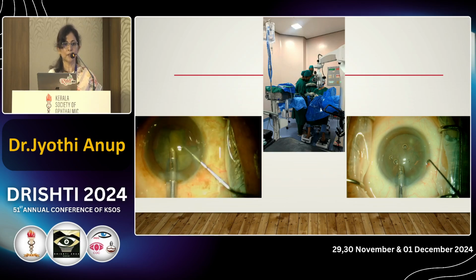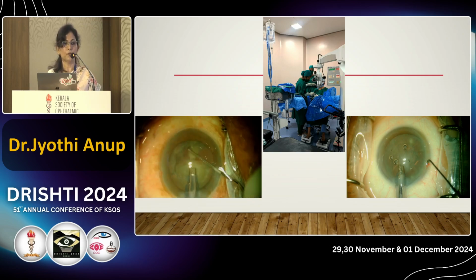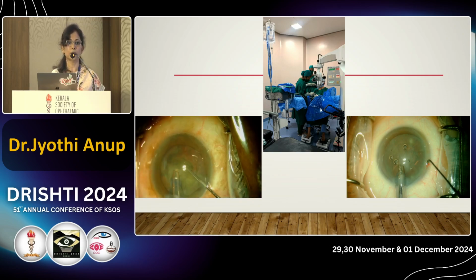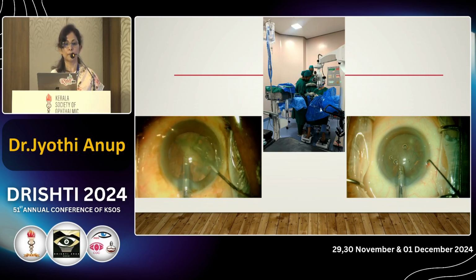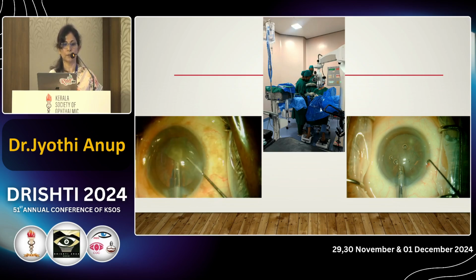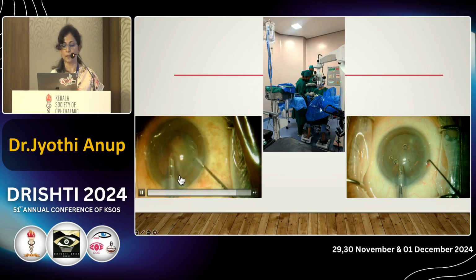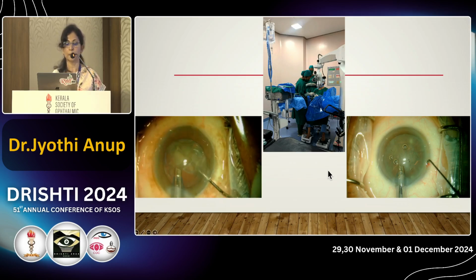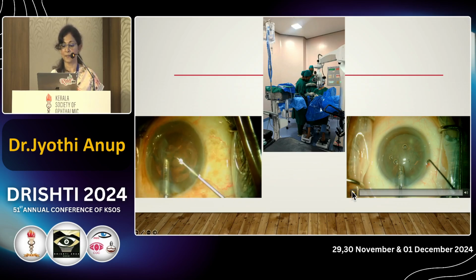And for a beginner phaco surgeon, it is better to inject visco before emulsifying each piece, as invariably you will be liberating some phaco energy, and that can spoil your cornea. So it is better to inject liberal viscoelastic, especially before emulsifying the last piece.